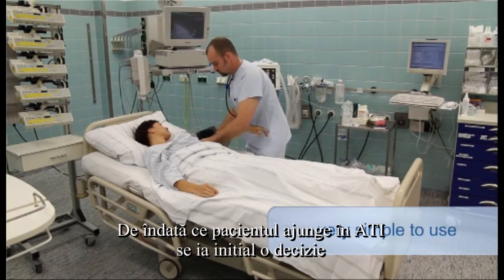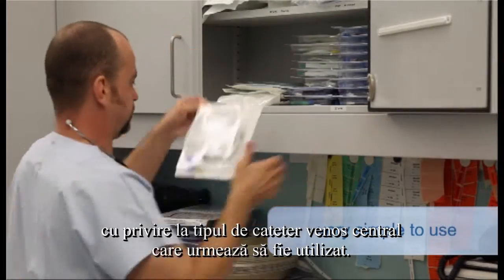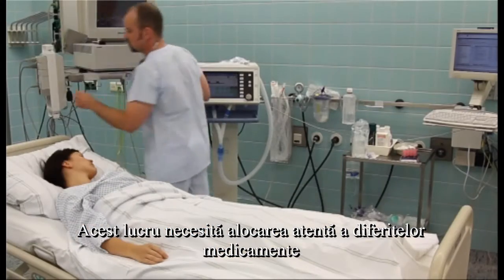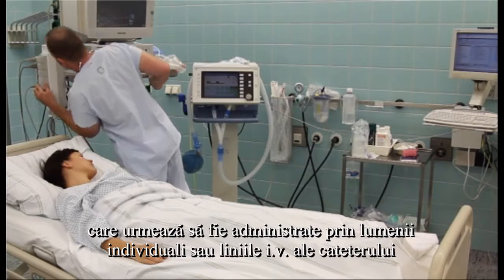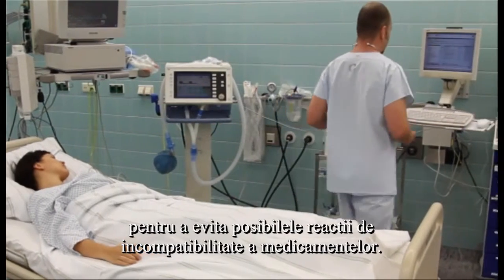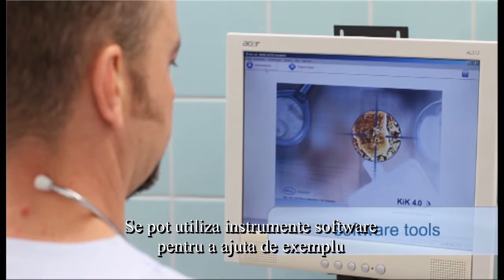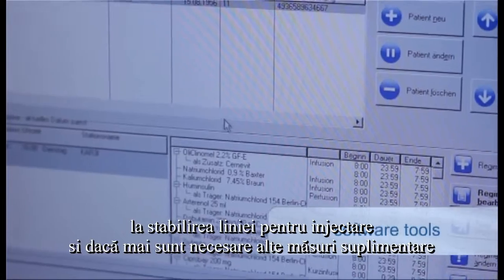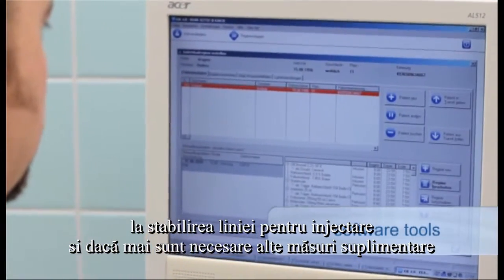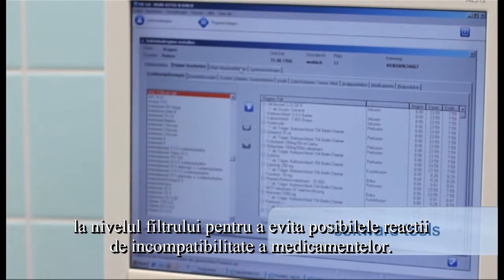As soon as the patient arrives in the ICU, a decision is made initially as to which central venous catheter to use. This requires careful allocation of the various drugs that are to be administered to individual catheter lumens or IV lines to avoid possible drug incompatibility reactions. Software tools can be used to help determine, for example, into which line to inject and whether any filter flush steps are additionally required in order to avoid possible drug incompatibility reactions.